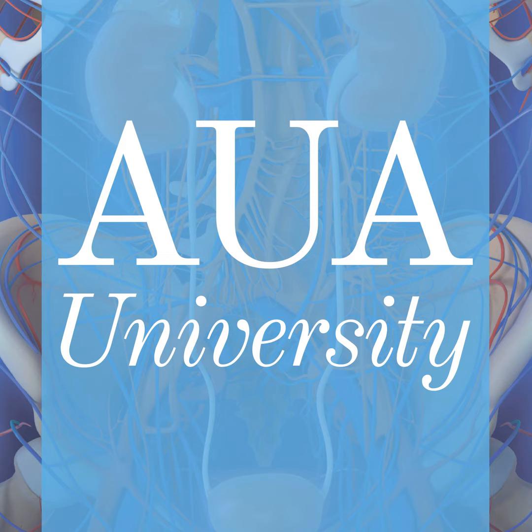The conclusion or takeaway from this study was that gallium PSMA PET is superior to conventional imaging. With positive activity, about 90% will have metastatic disease, and so in those cases you always perform an extended lymph node dissection. However, with negative activity, in 21% there are false negatives, and so once again, you cannot exclude a lymph node dissection in these patients, but we also need innovative imaging studies to be evaluated in order to spare the lymph node dissection.